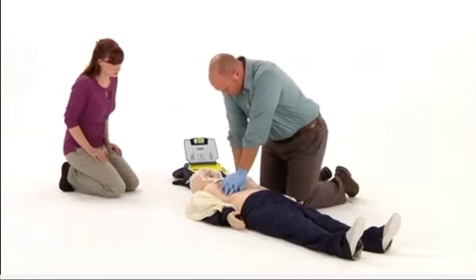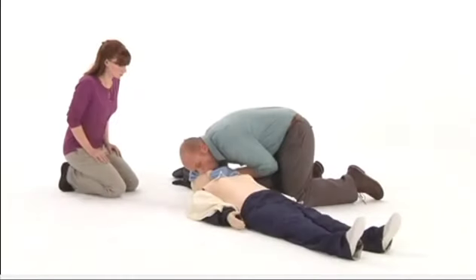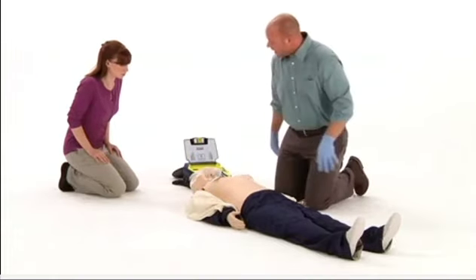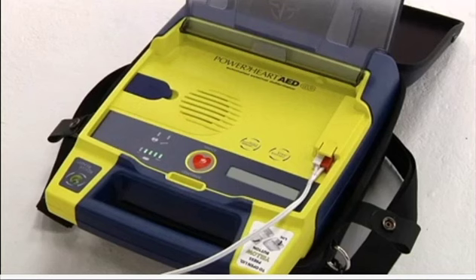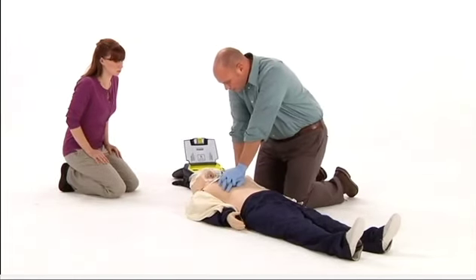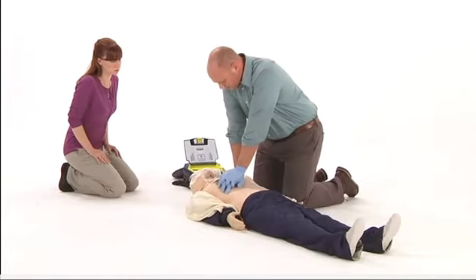Start CPR. After a shock is delivered, or if no shock is advised, give about 2 minutes or 5 cycles of CPR. When 2 minutes have passed, the AED should automatically begin to reanalyze the heart rhythm and will advise you with a prompt to stay clear of the person. Do not touch patient. Analyzing heart rhythm. Continue to follow the prompts of the AED and provide care as needed. It is now safe to touch the patient. Start CPR. If at any time you notice an obvious sign of life, such as breathing, stop CPR, maintain an open airway, and monitor for any changes in condition.